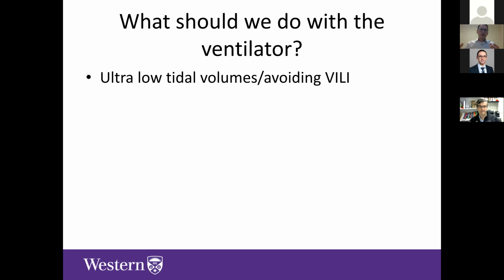You'll see some practice variation around that. And it's kind of analogous to, I think, when remdesivir was first on the scene, there was some excitement to use it, but we acknowledge that there's not a clear benefit. And outside of the research realm, we shouldn't necessarily be doing those things. And I think a lot of what people are trying on ECMO with the ventilator is in that realm.